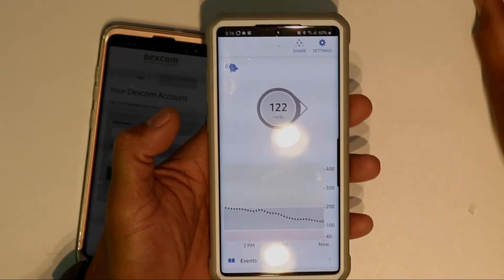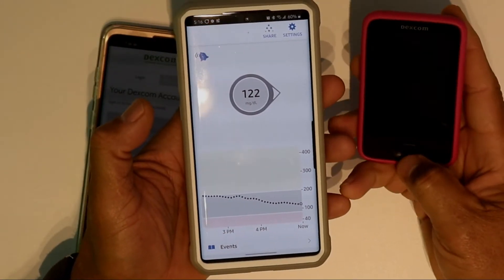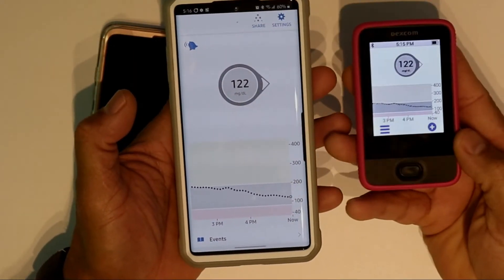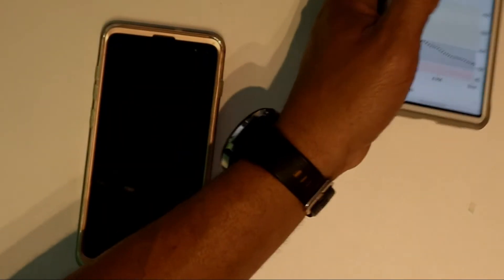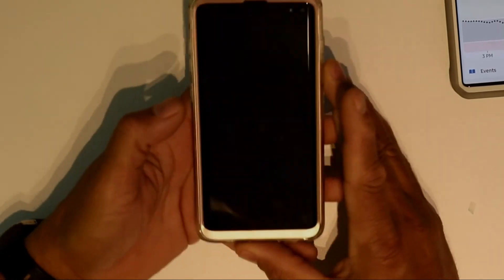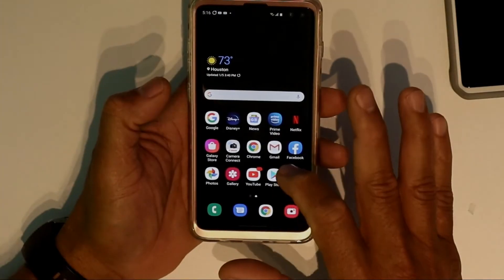You can see it's working almost perfectly here. Here's the machine, here's the receiver right there. Everything is working in sync with each other, so that's pretty good. I'm going to show you guys how to get it on your newer Android device.